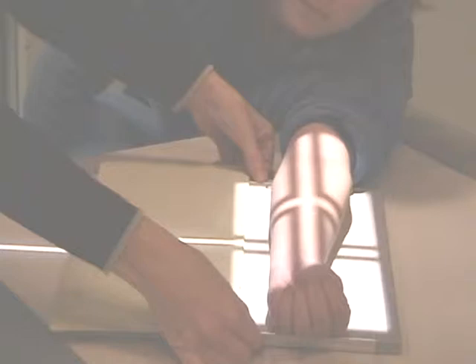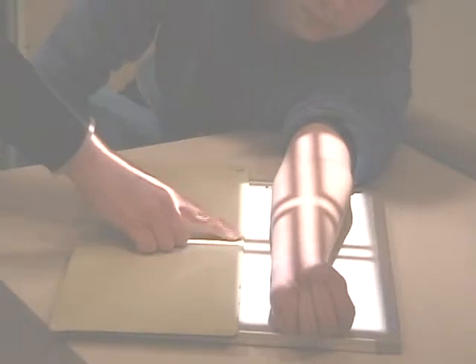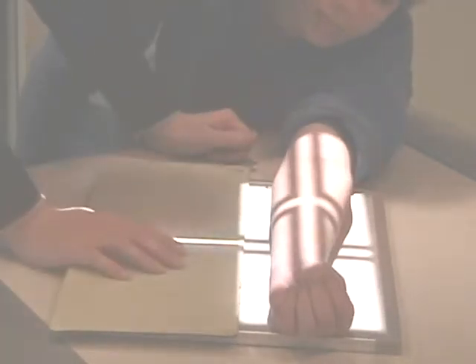And if you can look at the light, it's equal shadow on both ends, but I've opened the collimator up right to the edge of the film. Side to side, I have baby light on the sides of the strip here, and I've got a little bit of shadow on the inside of the cassette, and therefore I'm showing collimation.